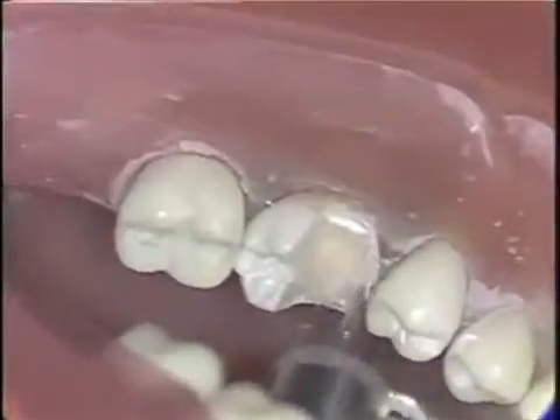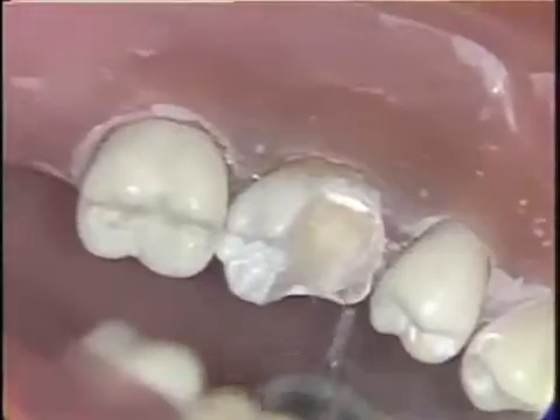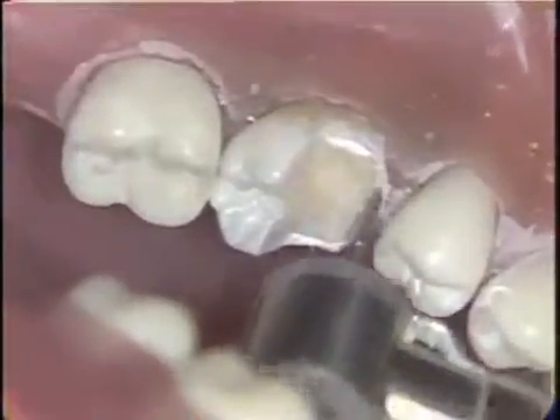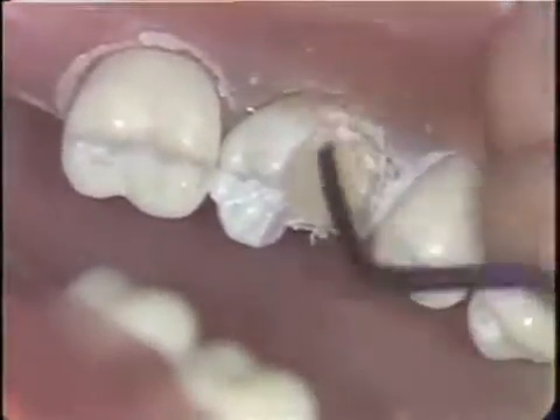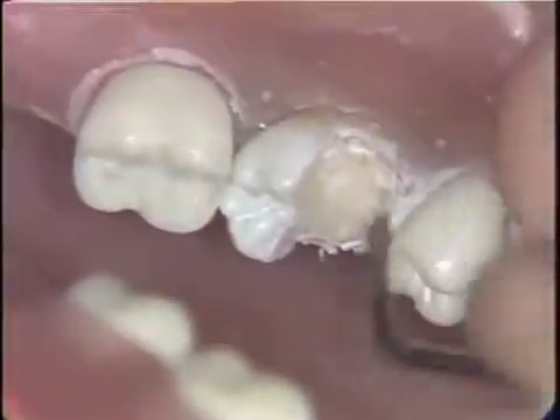The shoulder should be about at the height of the free gingival margin and should be about one and one half millimeters in width. Any unsupported enamel is now removed from the cervical area of the shoulder using a gingival marginal trimmer.